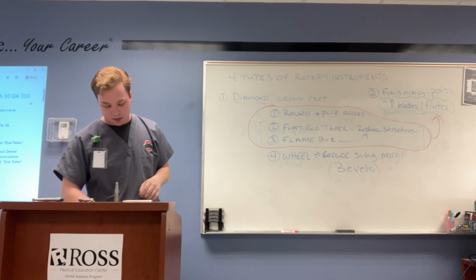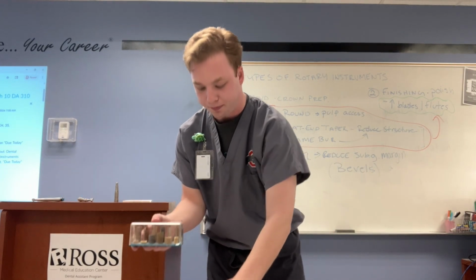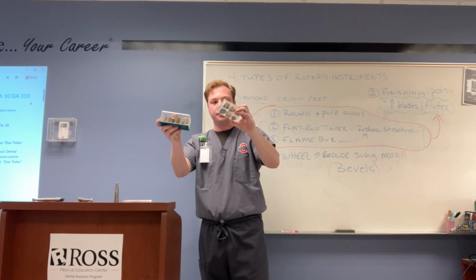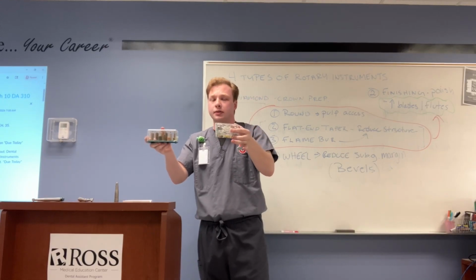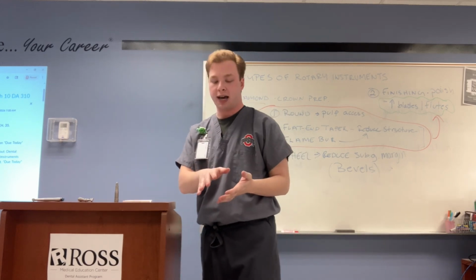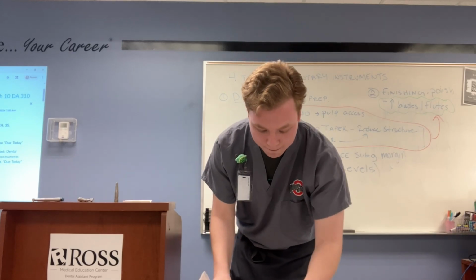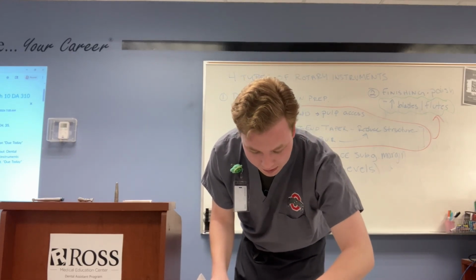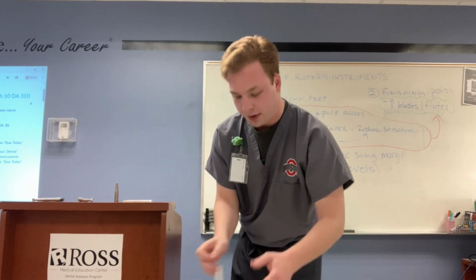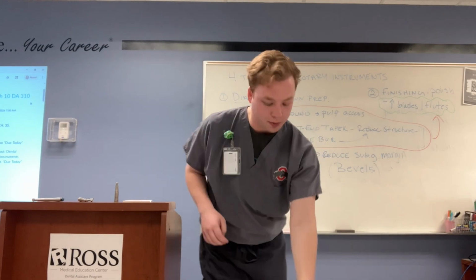And then the second one is I brought up examples of these. These are abrasive instruments. Now, these are discs, but they can't go on the instrument just like that. You have to have something to go with it. So there are some accessories, such as this accessory right here. It's called a mandrel. So let's talk about these real quick.